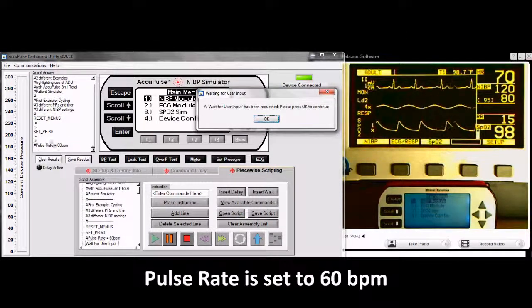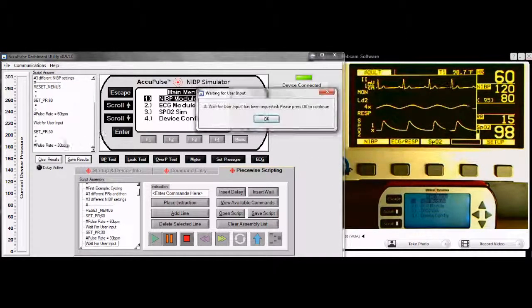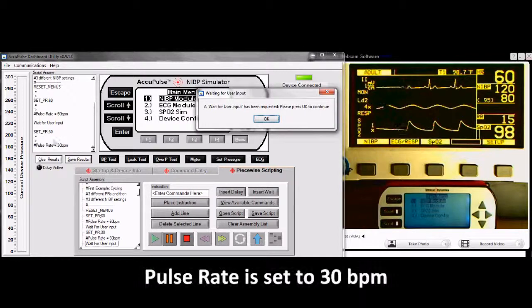The simulation data will be measured, recorded, and displayed on the Welch-Allyn Propaq monitoring system during this demonstration. However, the simulator produces physiologically correct signals that can be interpreted by any commercially available monitoring system.